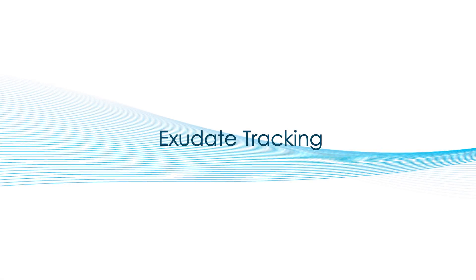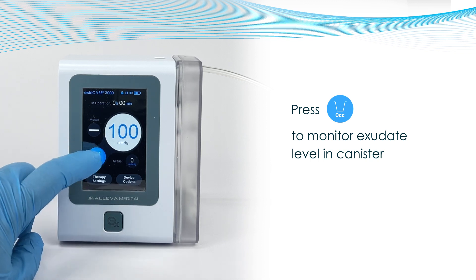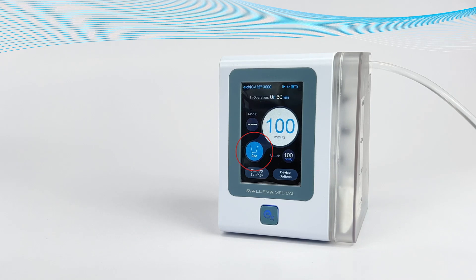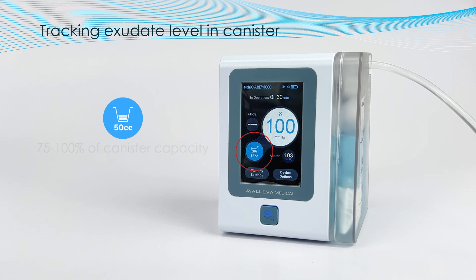Exudate Tracking. The ExtraCare 3000 has the ability to monitor the exudate level in a canister and the time to reach those levels. To see this, simply press down on the symbol that looks like a cup on the touch screen — this is the volume indicator button. As exudate goes up, the volume indicator on the button will also change. The ExtraCare 3000 unit will show exudate level at 25%, 50%, 75%, and 100% of the canister total volume.